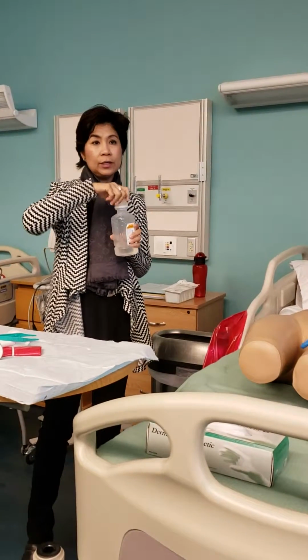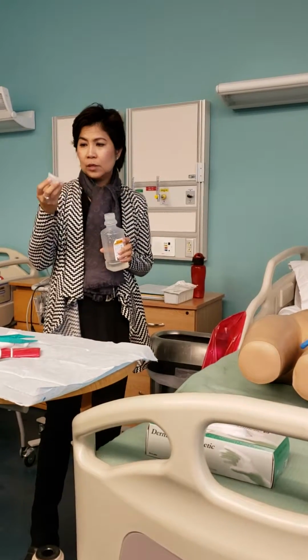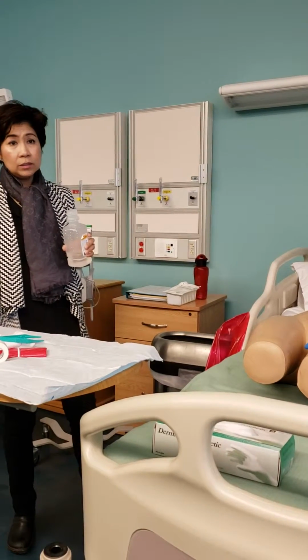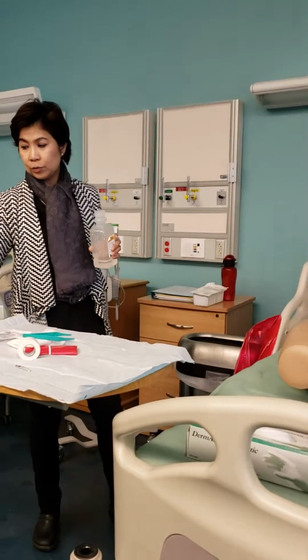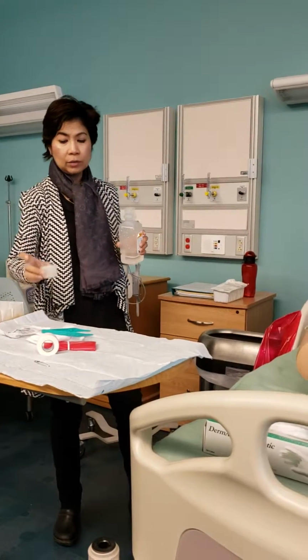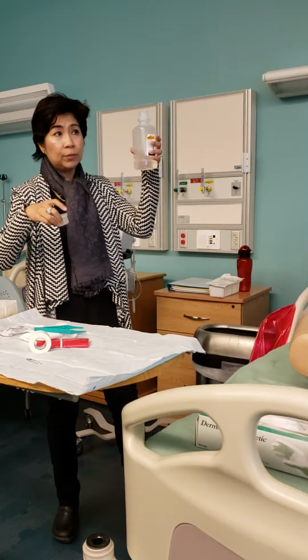So for sterile technique, once I open this one, do I set it up on the table like this? No. You want to stay sterile, so you set it on the table like this. Do I set it on the table here? No, because this is not sterile. You just got this from the supply room.